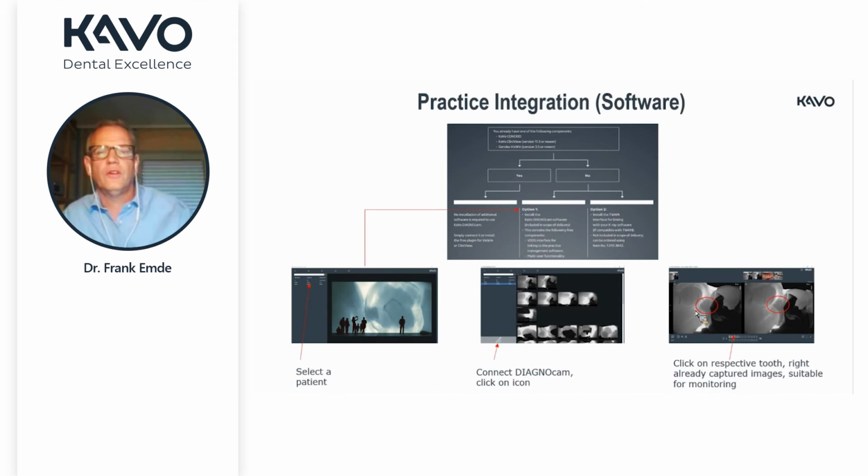There's a second option, if you have not connected the other software, which connects to KaVo and Xwin. The second option, if it's not connected, is that you can also connect it with Twain. If you're using a different X-ray source, a different X-ray software, it's not included in the package. What is included in the package, I would like to mention, is the use of Diagnostic with VDDS.